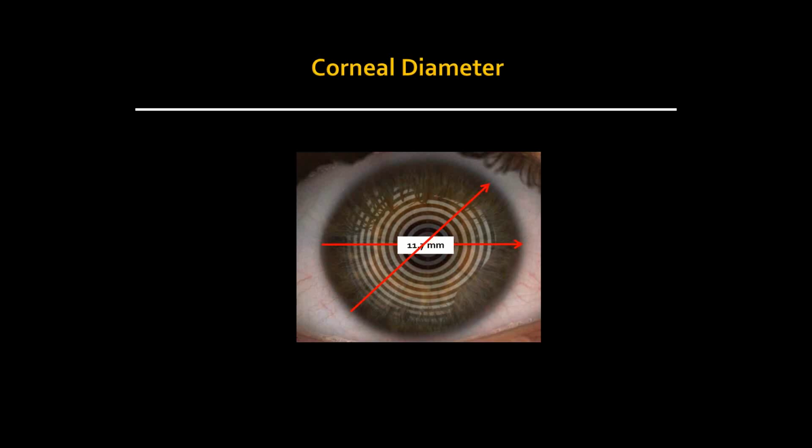The cornea is smaller in the vertical meridian. Therefore, when we take our diagonal measurements, we're not necessarily going to get the same value as we are for our horizontal measurements. Now, this is in millimeter values. However, this could represent a transition into our overall fits.